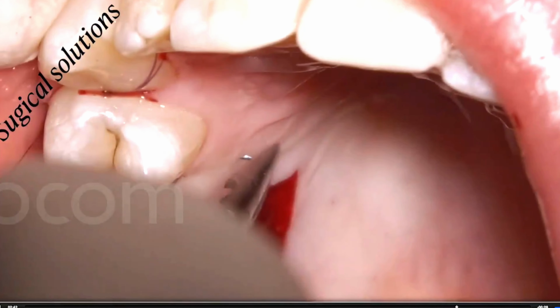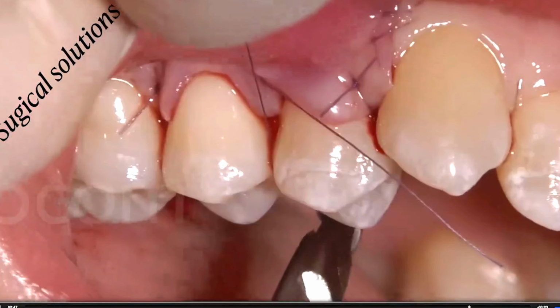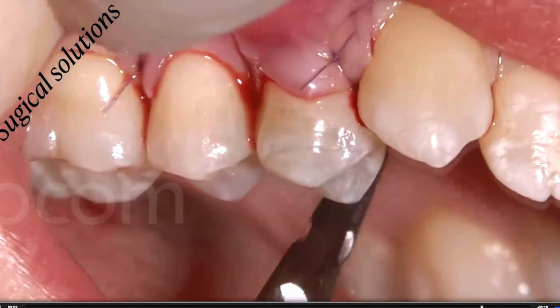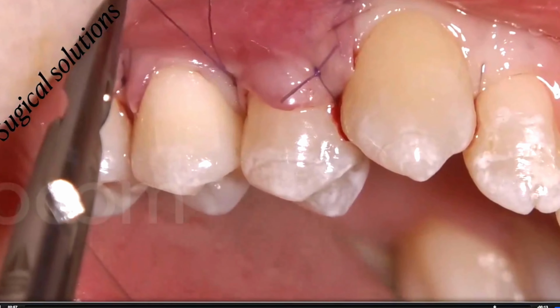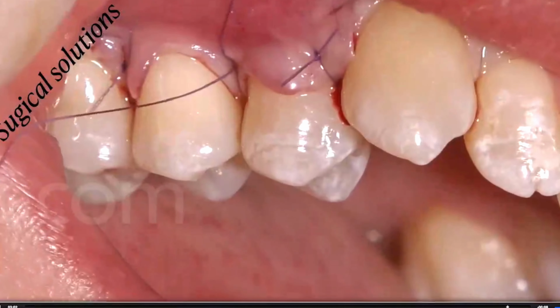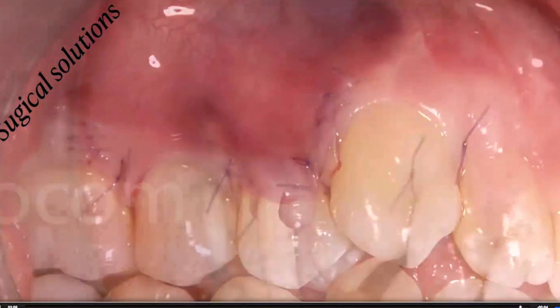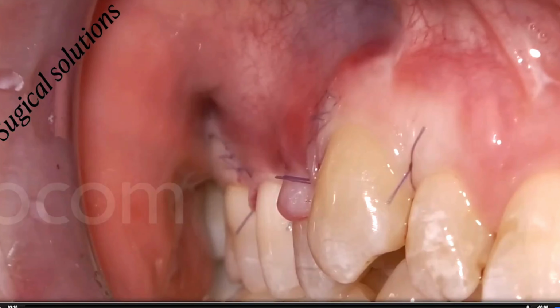Take anchorage in the palatal aspect with a mattress suture, go back below the contact point or above the contact point and close. So this is a very, very site-specific compression of the surgical papilla above the anatomical papilla at the base with no risk that during the sling, this suture can be moved mesial or distal. So you need a compressive suture in the middle. So there is something that you can do during the flap design, during the flap elevation, during the sequence of the suture in order to improve the coverage.